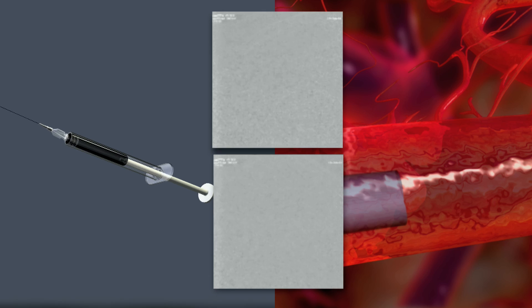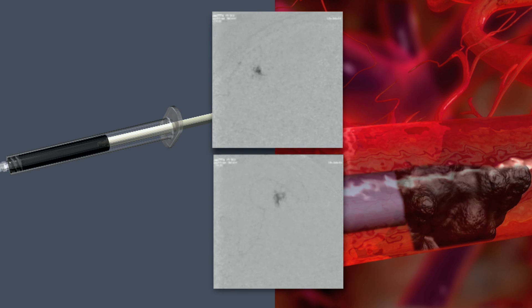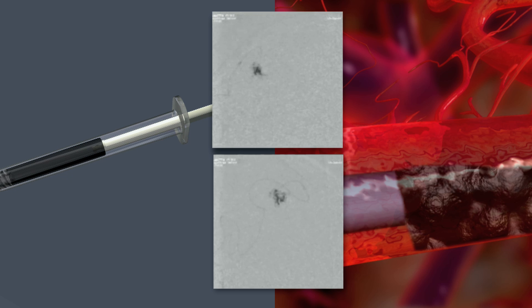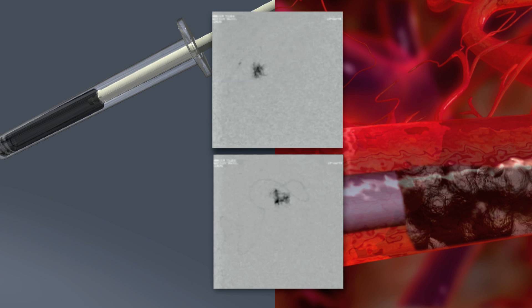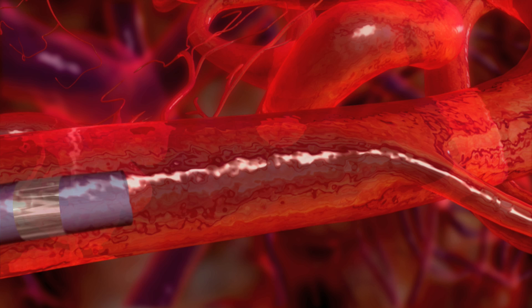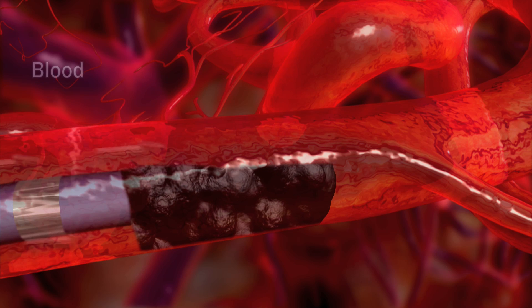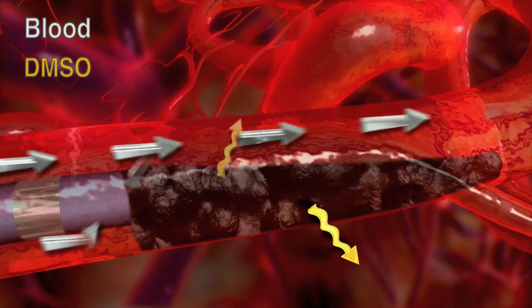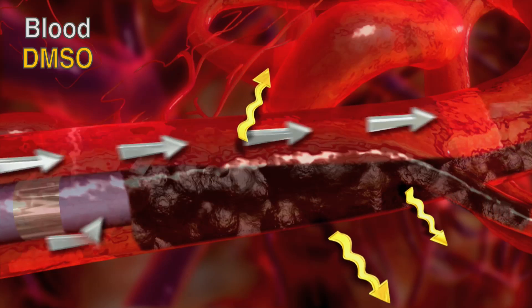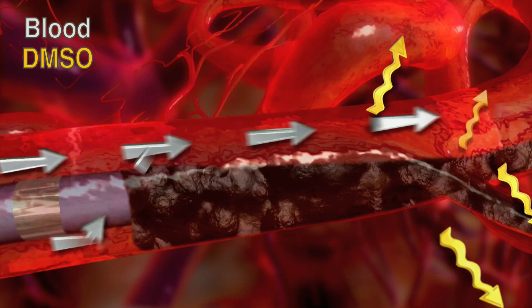Begin fluoroscopic imaging just prior to displacing the catheter dead space volume. If visualization is lost at any time during the procedure, halt Onyx delivery until adequate visualization is re-established. Onyx advances because it is pushed. Often compared to how lava flows, Onyx begins to solidify from the outside while the inner core remains liquid for a given duration. Onyx follows the path of least resistance, and at times flow dynamics within the nidus can make that path retrograde, causing the Onyx to reflux.